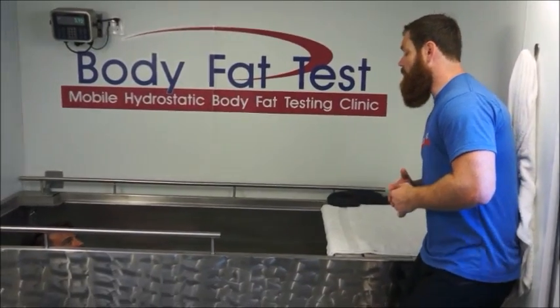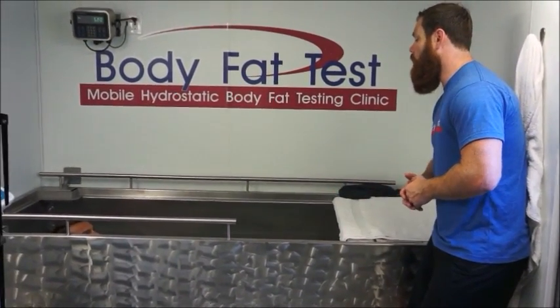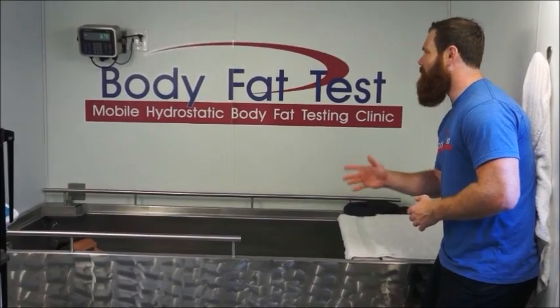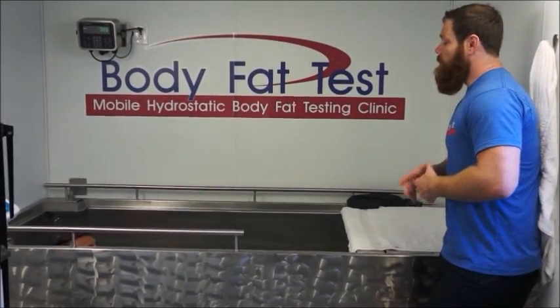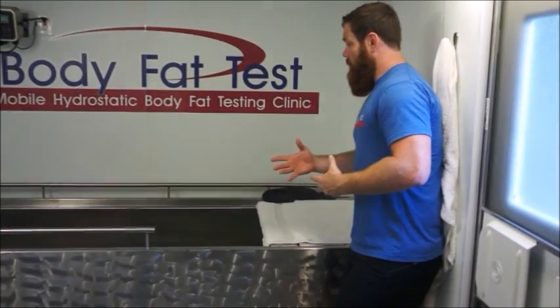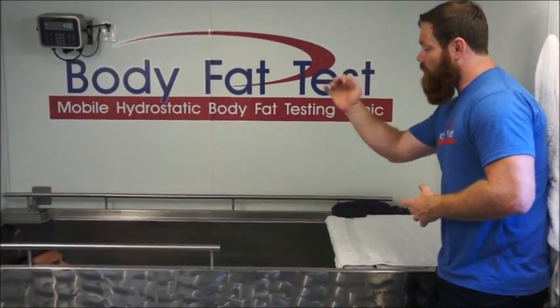All that being said, you're going to submerge yourself and blow all your air out underwater. Are you okay with that? Yep. I'm going to have you plug your nose and start blowing your air out.